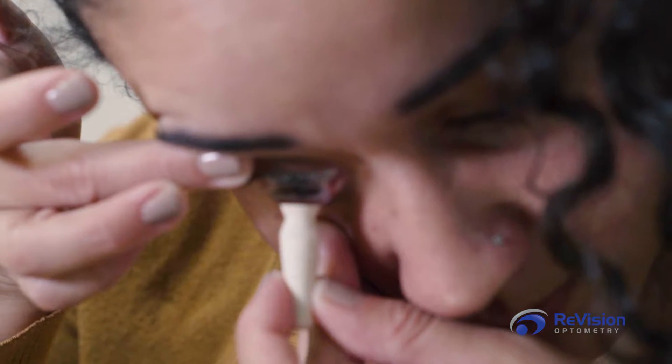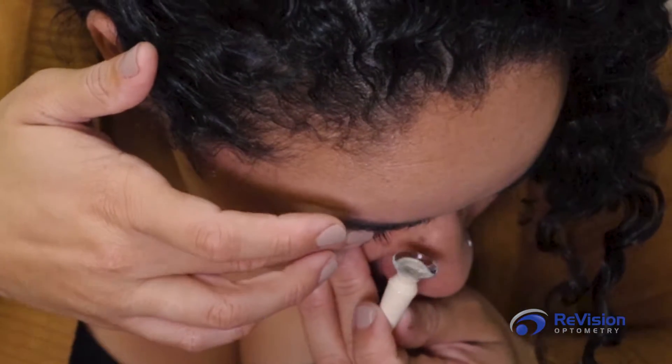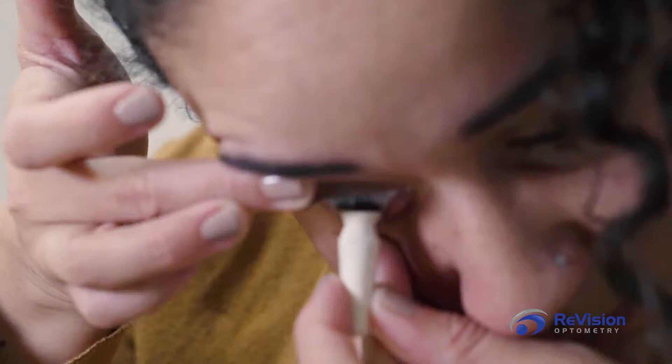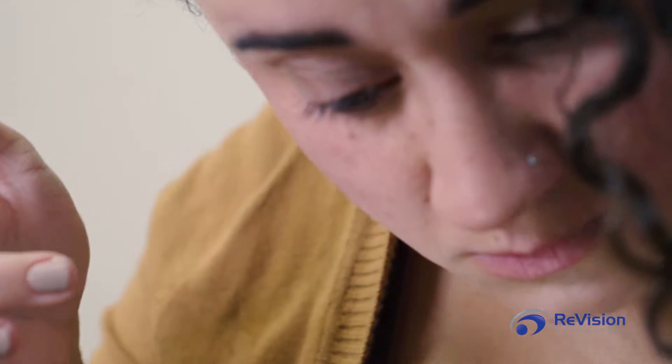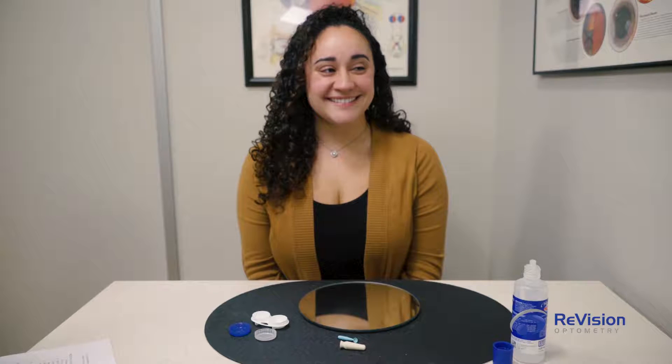Apply the scleral up to meet your eye. You will feel the solution on your eye, but do not pull your hand away. Gently press the lens onto your eye. Once the scleral is applied, release the hand holding your upper eyelid open, then remove the hand holding the plunger. Congratulations! You have successfully applied your scleral contact lens. Repeat the steps on the other eye.